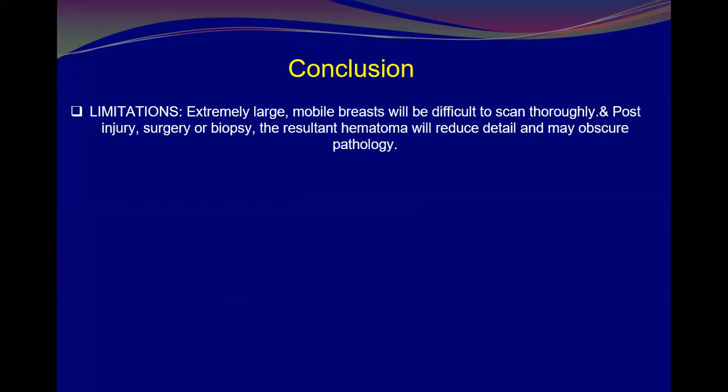And the limitations of mobile and hugely large breasts should be considered. Post-injury, surgery, biopsy, or resultant hematoma can all give limitations for ultrasound and obscure underlying pathology.